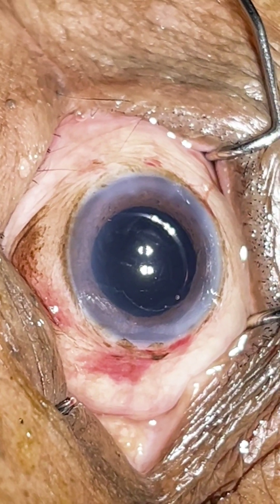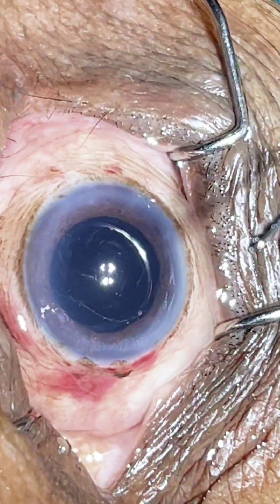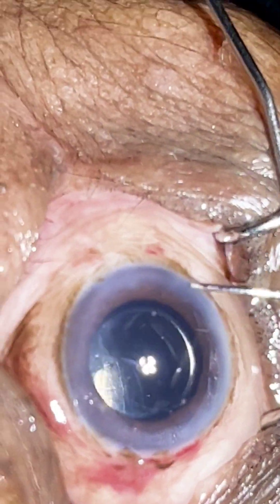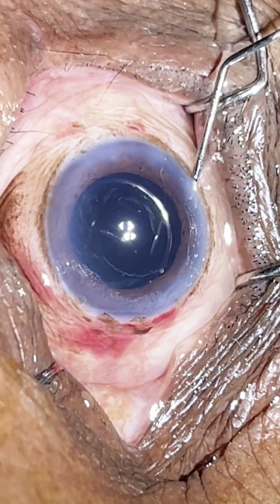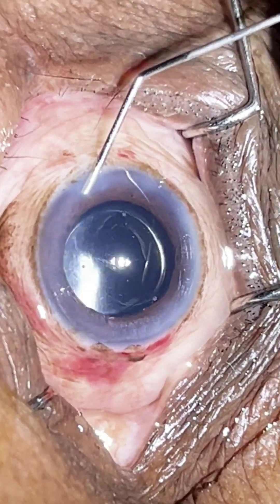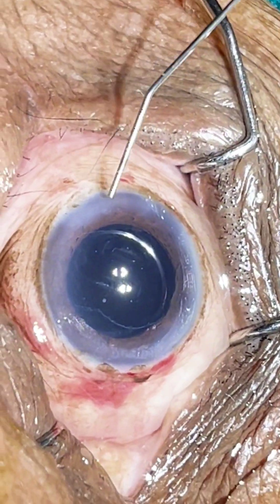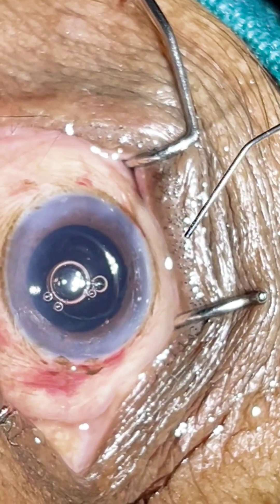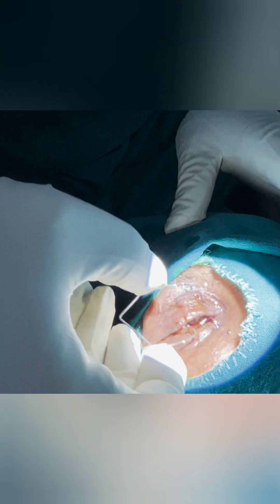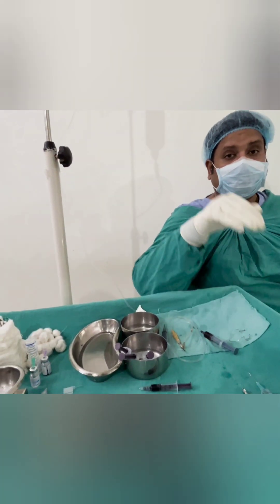This completes our phacoemulsification cataract surgery with IOL implantation. In the case of a diabetic elastic cataract, where the endonucleus is greenish in color and very very elastic, it becomes difficult to chop. Such cases have difficulty in getting a grip on the nucleus. What we do is make a groove in the deeper plane before chopping — first make a deeper plane groove, and after making the groove, then proceed with the chop.